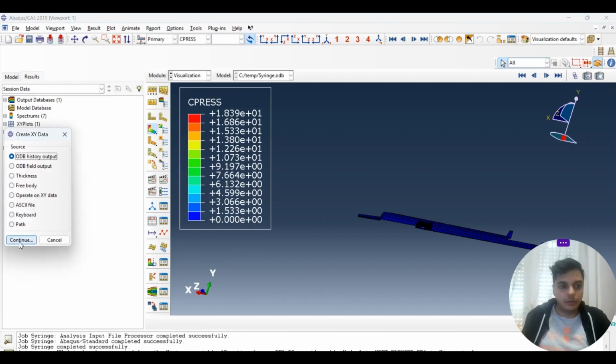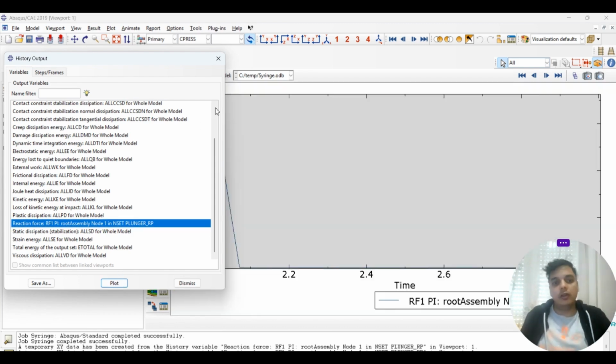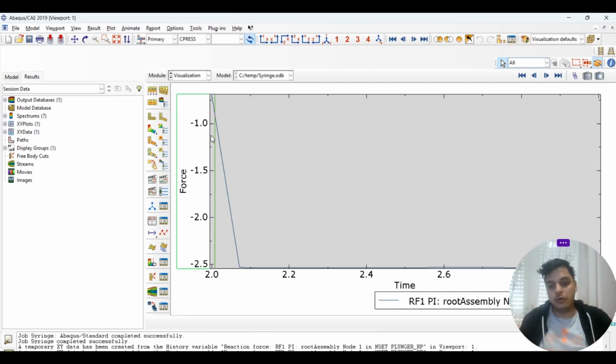Now what else we can do is the plotting. So we define ODB history output. Continue. If you remember, we have defined the reaction force 1, RF1. So here it is, and we want to plot it. This is the reaction force that we just got for our analysis. How much force we need to pull the syringe, and also make sure that this is for a quarter part of it. So we have to do the operations here.